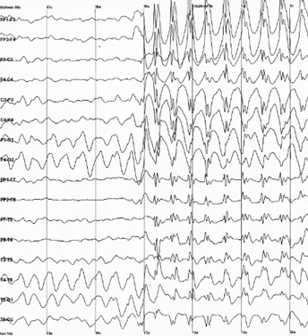Electrical signals detected along the scalp by an EEG, but that originate from non-cerebral origin, are called artifacts. EEG data is almost always contaminated by such artifacts. The amplitude of artifacts can be quite large relative to the size of amplitude of the cortical signals of interest. This is one of the reasons why it takes considerable experience to correctly interpret EEGs clinically.